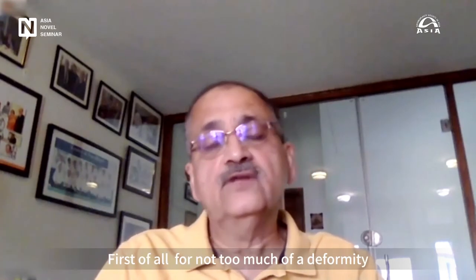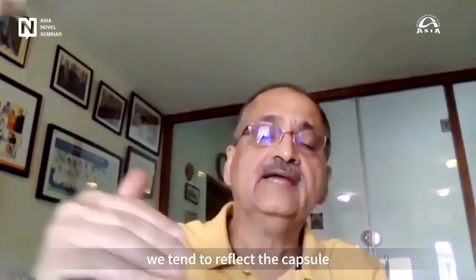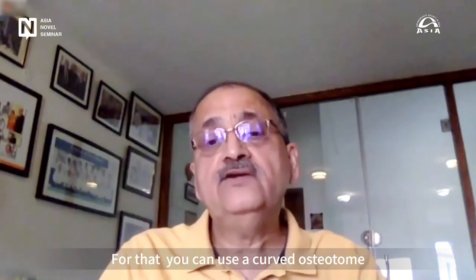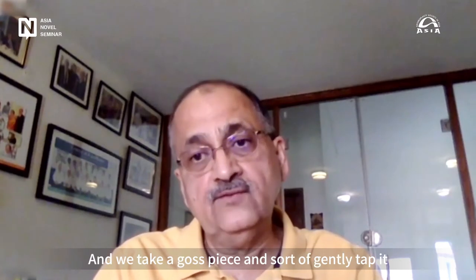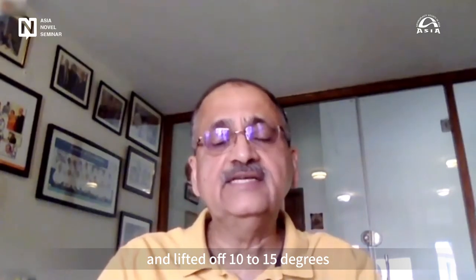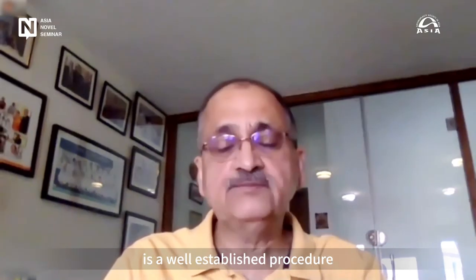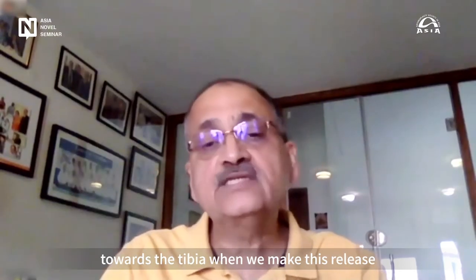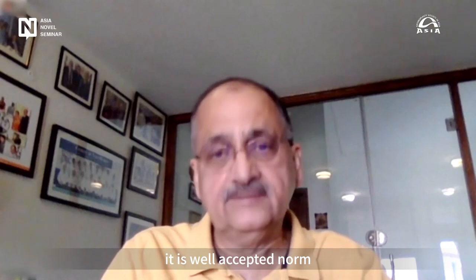First of all, for not too much of a deformity, we tend to reflect the capsule from the back of the femur. For that, you can use a curved osteotome, and not a sharp one, and we take a gauze piece and gently tap it and lift it off, and 10, 15 degrees easily get straightened. I agree that posterior capsulotomy is a well-established procedure. It can be done in many ways. What we do is we go slightly more distal towards the tibia when we make this release. But if you are cautious and well away from the neurovascular structures, it is a well-accepted norm.